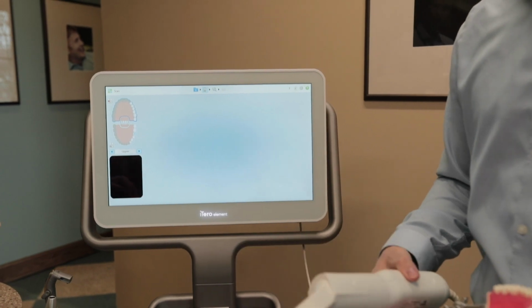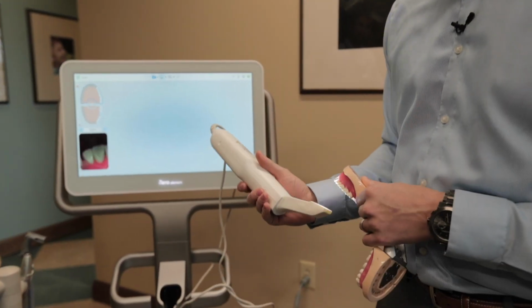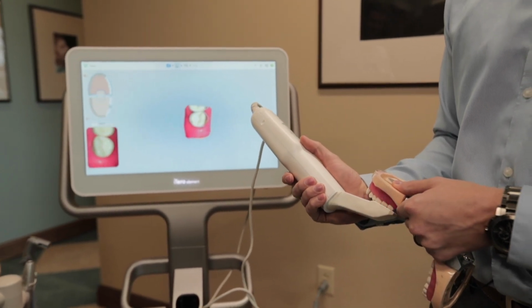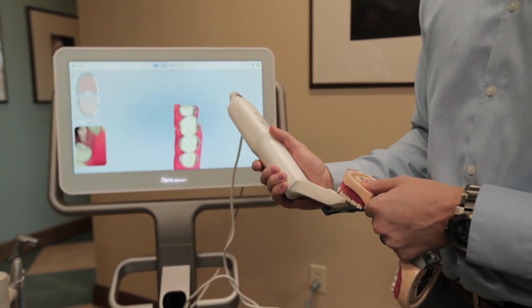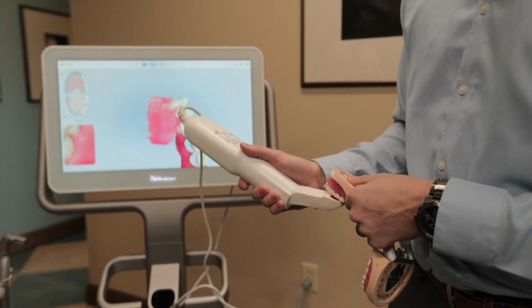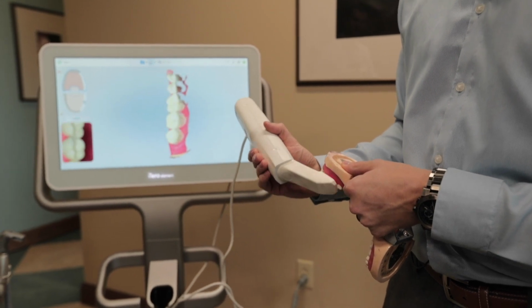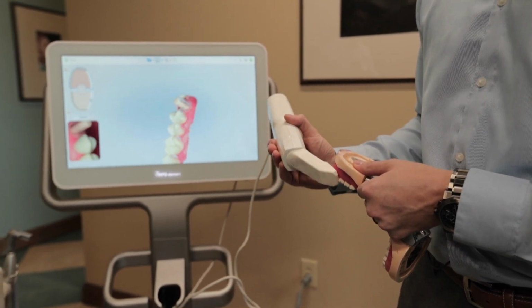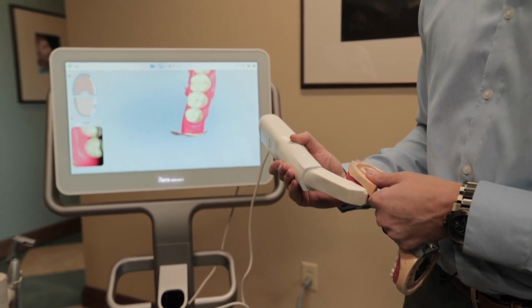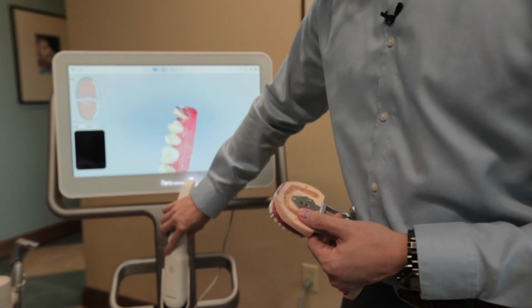We're going to go ahead and do our opposing arch. I'm just going to flip this around here. This poor patient, just kind of manhandling them around. All right, so start on the occlusal. Again, same thing. Occlusal, lingual, buccal. All right, now here, really what we want is to make sure we have a nice clean occlusal surface, and also make sure we have enough on the buccal and the lingual.